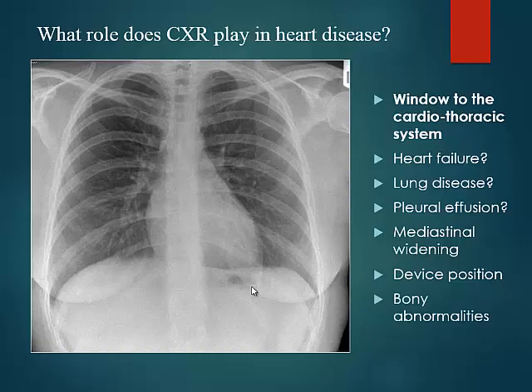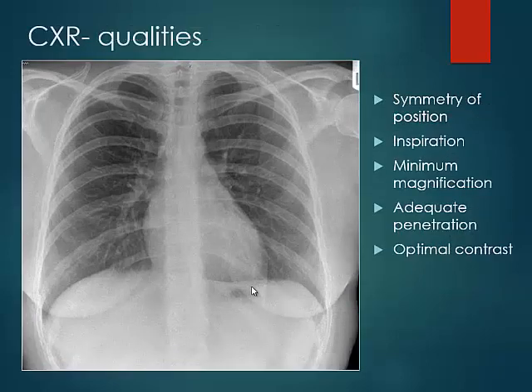And bony abnormalities. Certain bony abnormalities can reflect on presence or absence of certain cardiac conditions. Okay, so those are the main indications.